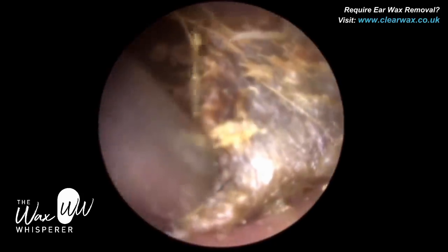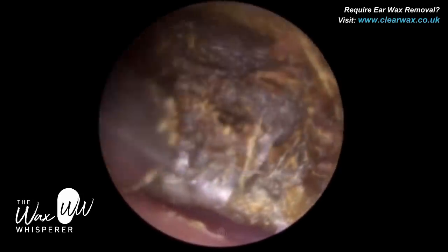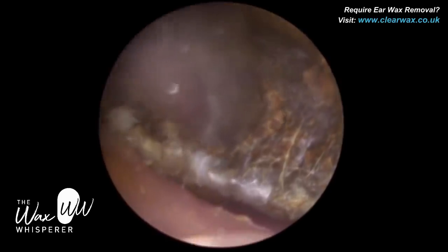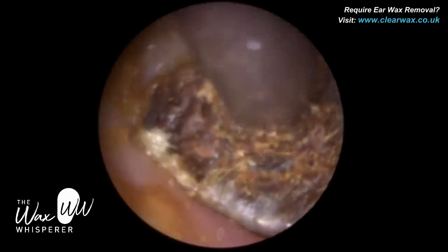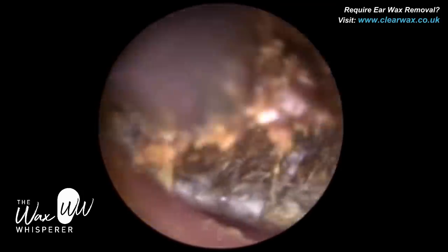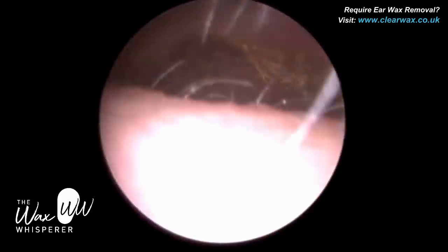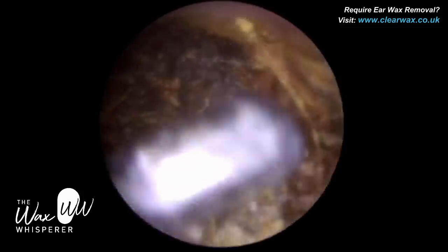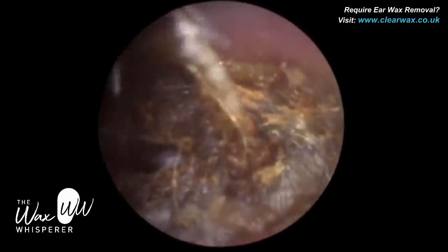I can't use forceps — there's nothing for me to grip onto. If the patient were asleep or had local anaesthesia — neither of which is what I do — I would just be a bit more aggressive and get an earhook right behind it, even if it causes a bit of trauma. My patients are awake; we don't use anaesthesia. In the UK an audiologist is not able to prescribe or administer any local anaesthesia like lidocaine. It's a bit frustrating, and I think something needs to change.